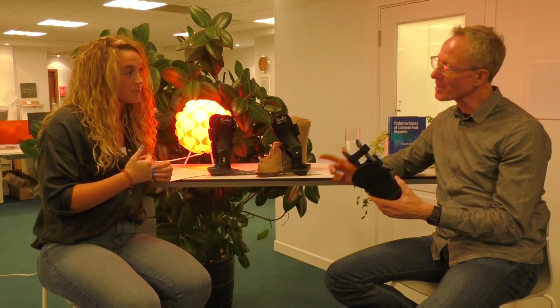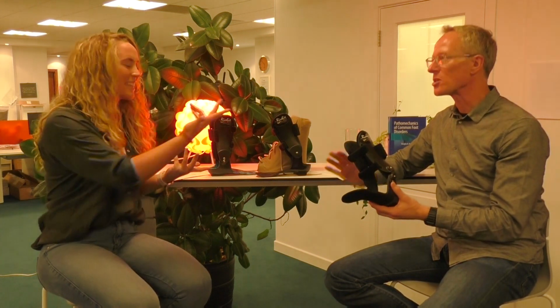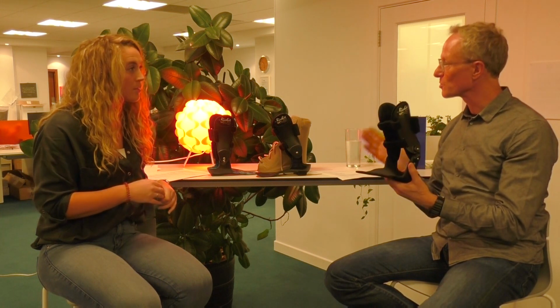I would maybe add that it's probably even more about the diagnosis. Because recently I had someone that had a significant syndesmosis injury, lateral ankle inversion, rupture of all the lateral ligaments. They also had a lesion on the talus. And what we wanted to do was to splint it. Now their ankle joint movement was quite good. But what we said was, no, we're going for fixed hinge.